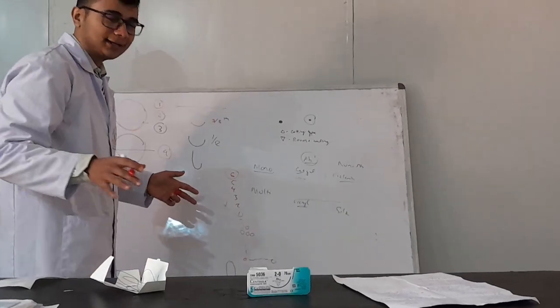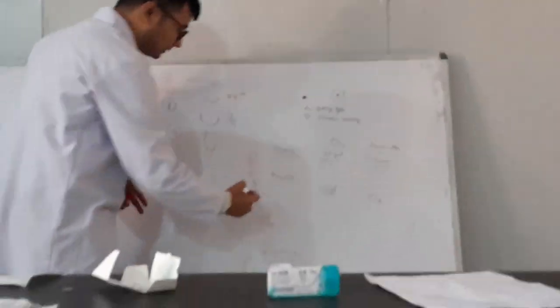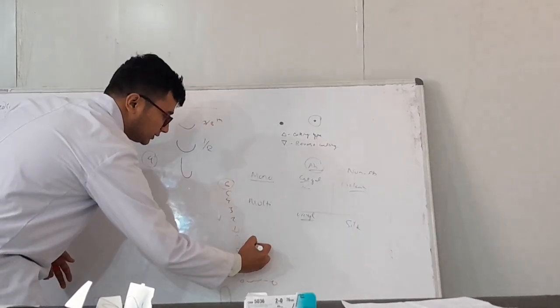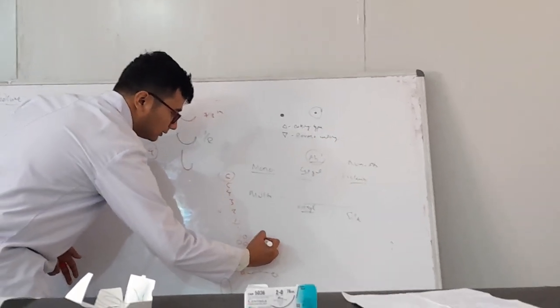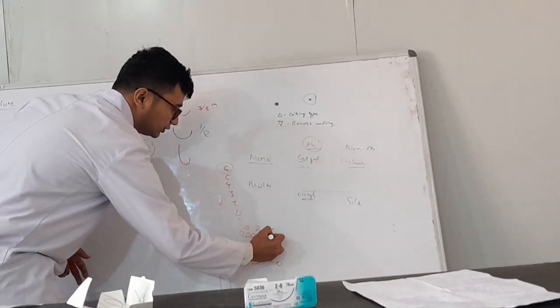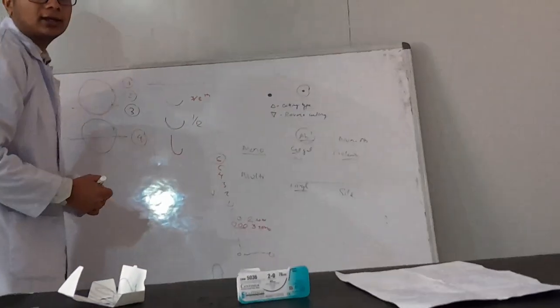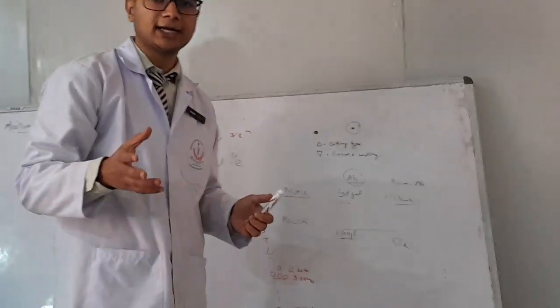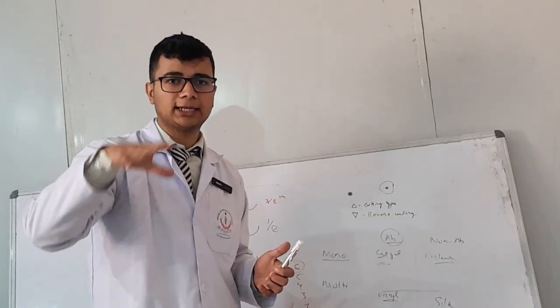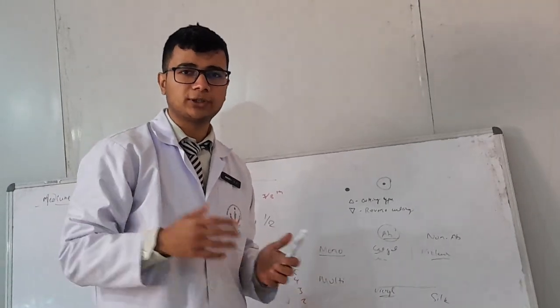So for that, it has now been renamed: 0 is 0, if it has 2 zeros it means 2-0, and 3 zeros means 3-0. Now there is also a 7-0 size, which is said to be equal to the caliber of our hair filament. So that is one extra point you can keep in mind.